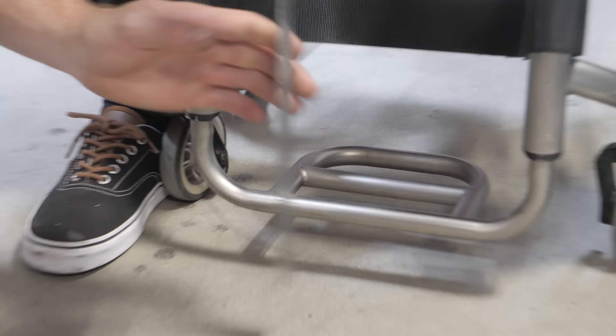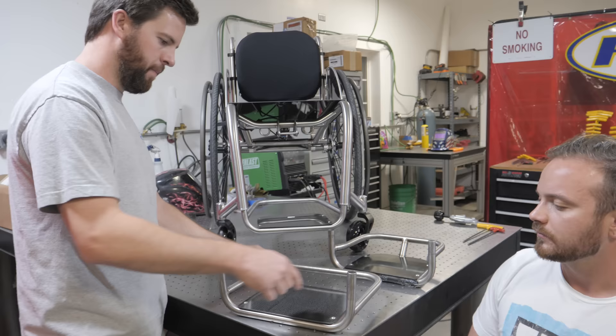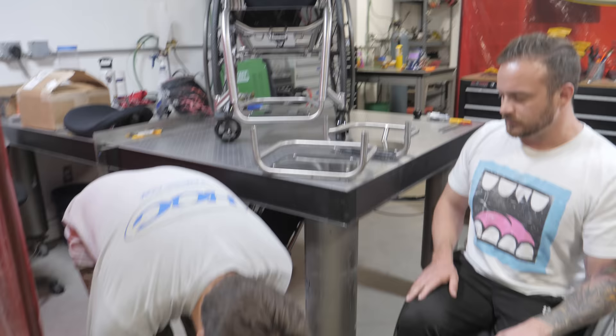Now we are going to measure the foot plate width, height, depth, and angle, and then decide what foot plate style I want. These are all our alternatives to the calf straps — we call them double foot hoops. This one goes straight back with no taper. This one has a little bit of taper. And this one is kind of like the ergo front end of the chair — it's got a bend then goes straight back, just to keep your feet in place so they don't splay.